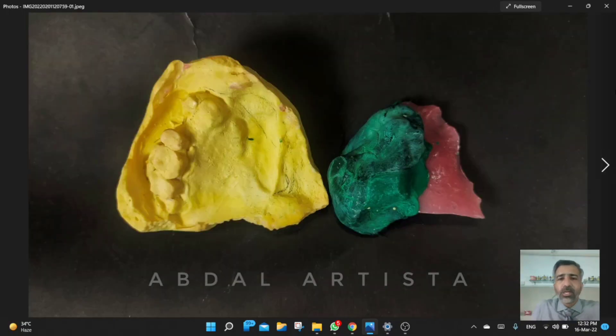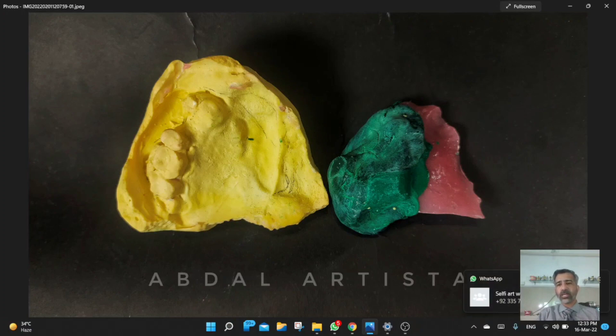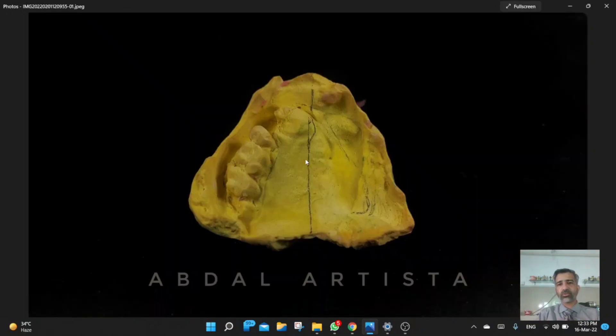We fabricated an impression tray using cold-cure (self-cure) acrylic, which was extended to cover the defect area. Using low-fusing impression compound — known as green stick in our region — tissue molding was done and the impression was taken. The defect part was recorded using this tray, which was then joined to the dentate impression tray. After that, both parts were pulled and we had the final combined impression.